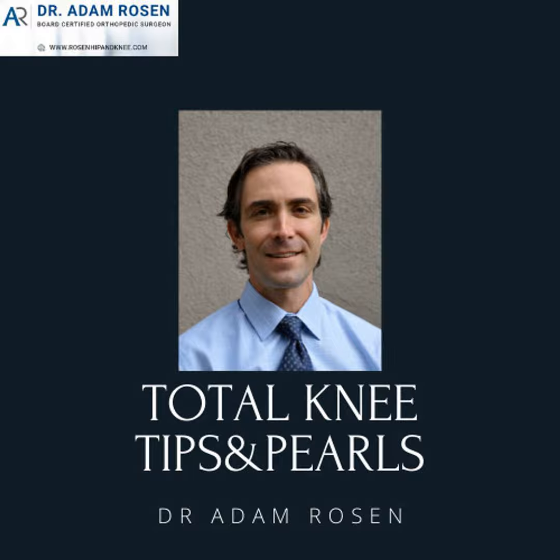So if they had an old incision that was of an appropriate length, I tend to go a centimeter or two above and below. And what that allows me then to do is to better define my tissue planes as I get deeper, because I'm going into virgin territory in those areas above and below. So I'll mark out my incision ahead of time when I'm doing all my prepping and draping. And at this point, then I will excise the scar.